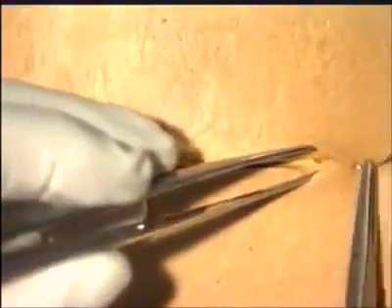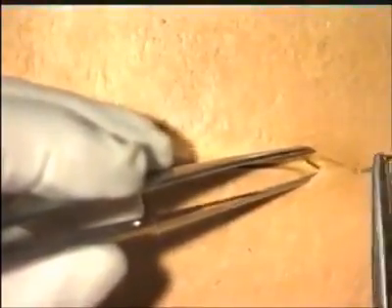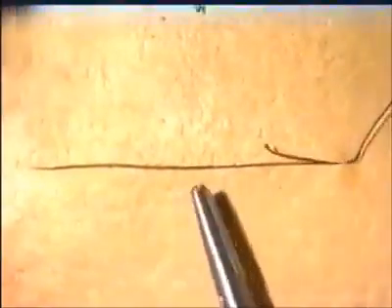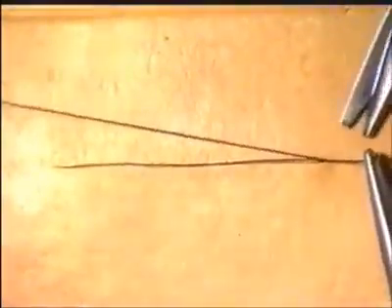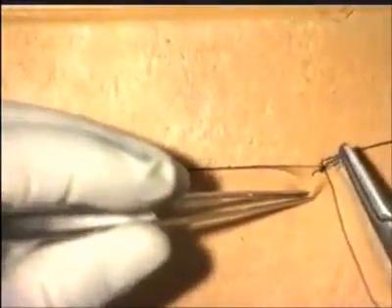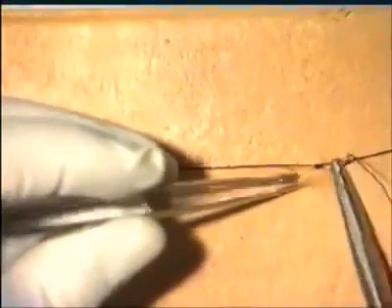Start the subcuticular suture by inserting a knot at the far end of the incision. Tie a standard reef knot, and then cut the short end of the suture very short, as we are going to bury the knot. Then, using the forceps, carefully retract the skin edge. Take a small bite of the subcuticular material, and pull the suture through.